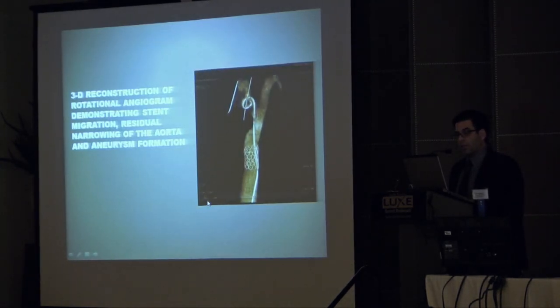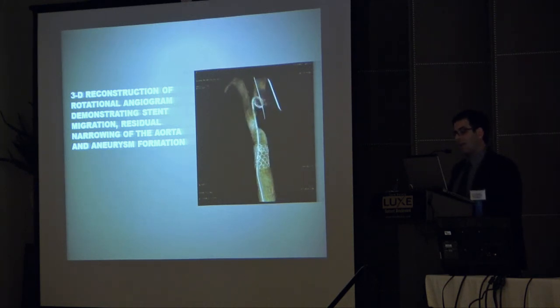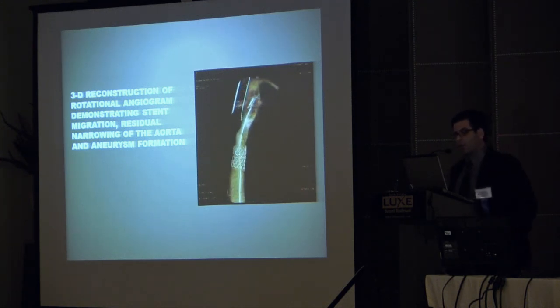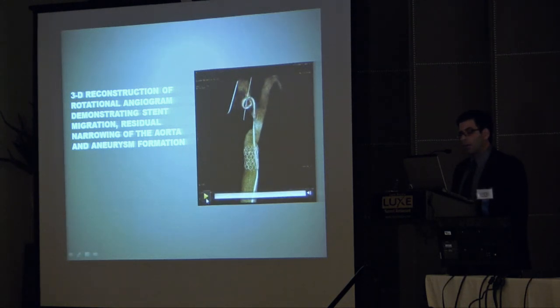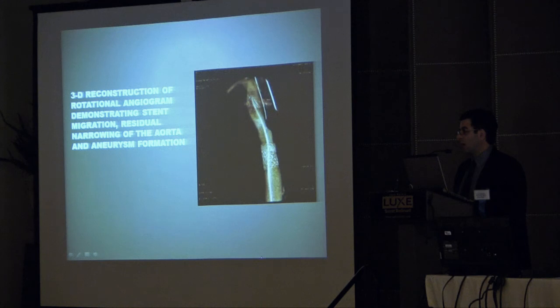You know, here's an example of somebody that was taken to the cath lab actually by Dr. Levy after the patient came to see him and had a really high residual gradient after a coarctation stent done elsewhere. So he took them to the cath lab to see what was going on. The stent looked a little bit low, and did a rotational angio with the pigtail here in the aortic arch, and that 5-second spin, and then reconstructed the aorta.